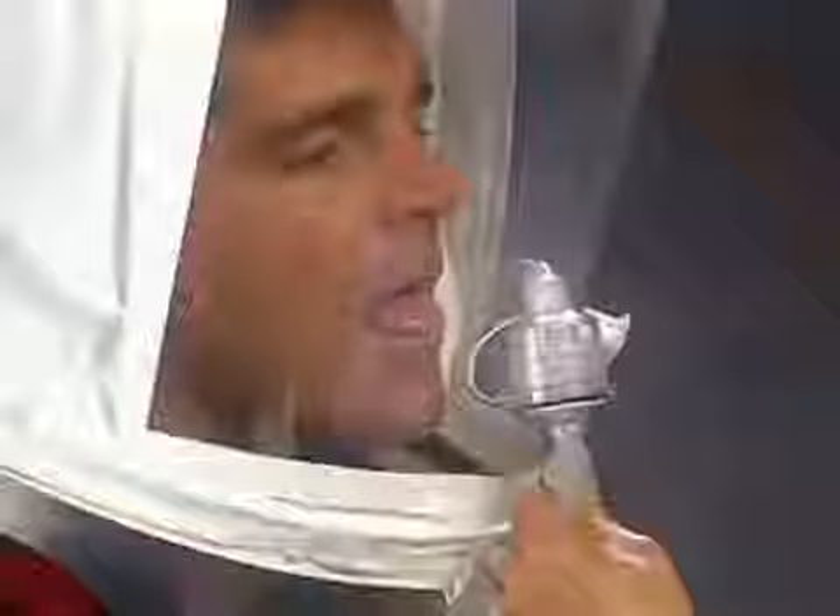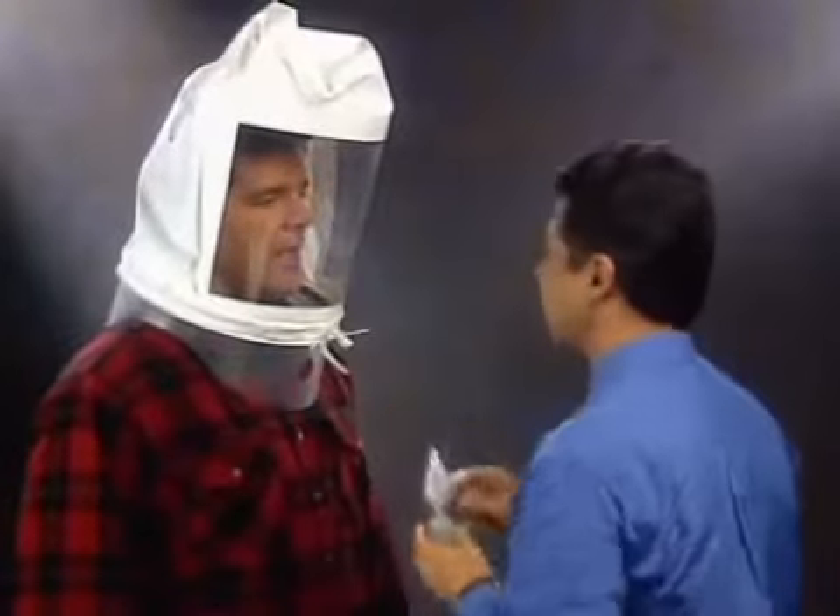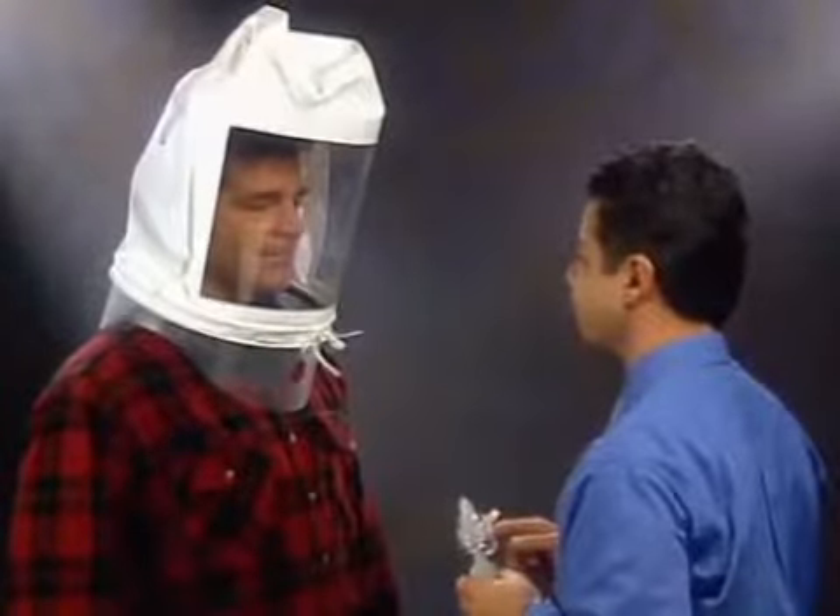If you still can't taste the test agent after 30 squeezes, the test is over. You can't be tested using this material. Once it has been determined at what level — 10, 20, or 30 squeezes — that you can taste the test agent, you'll remove the hood and wait a few minutes to clear the taste from your mouth. Rinsing your mouth with water may be helpful.